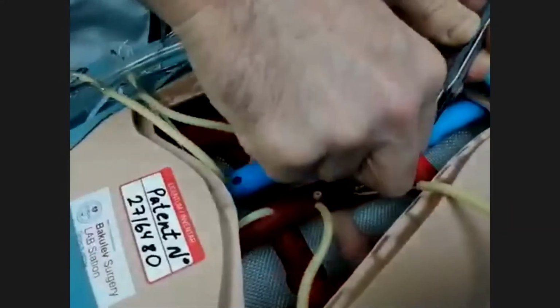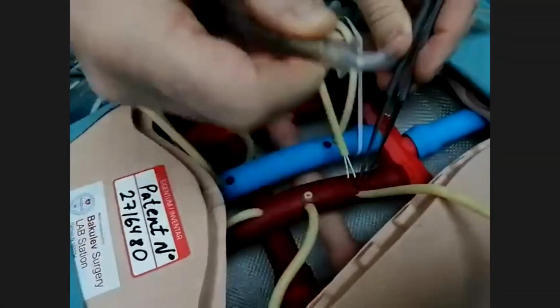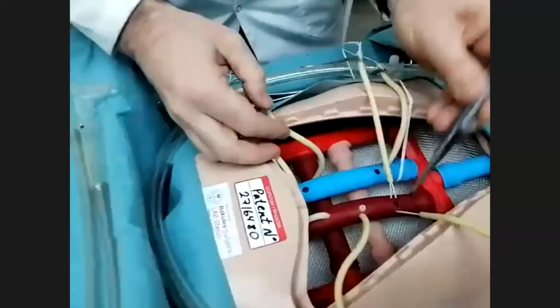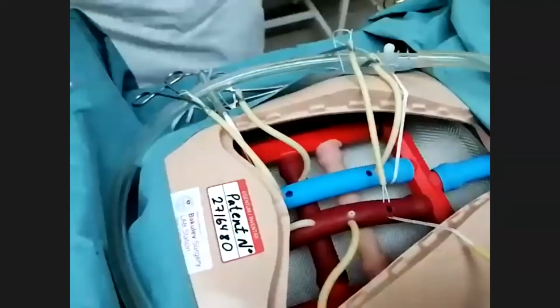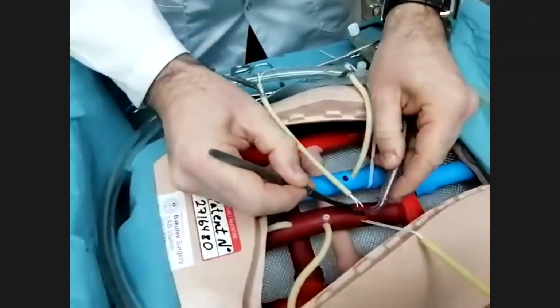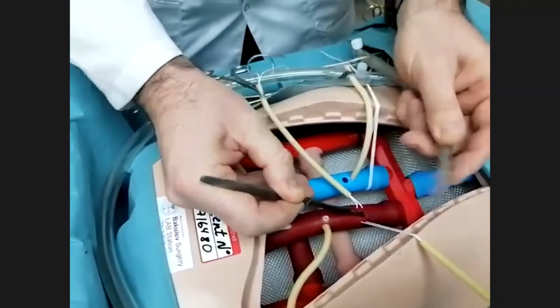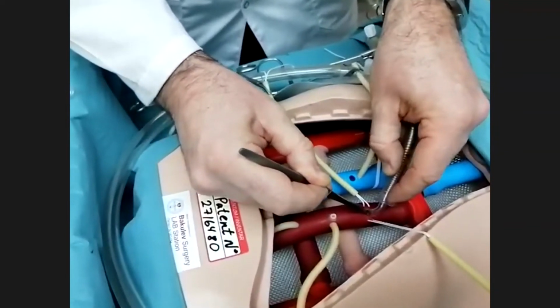This is going to be a mess of blood, isn't it? Yes, I block the blood with my pincet here, or if I use the technique by left hand, it's very rapid. You have to do this very rapidly, just like this.